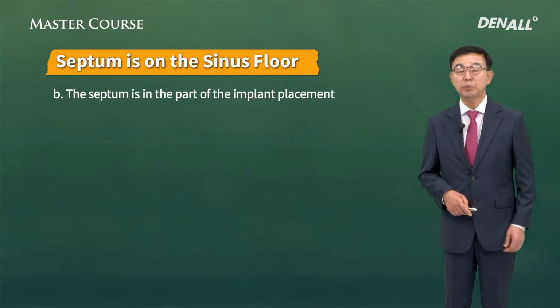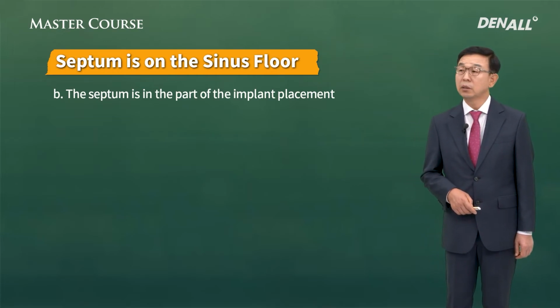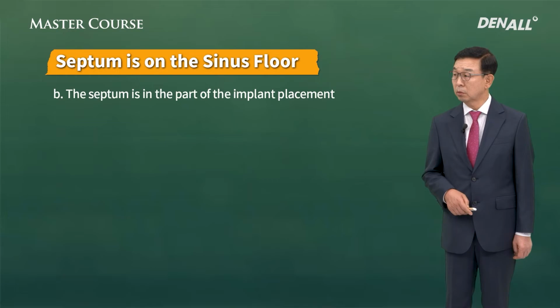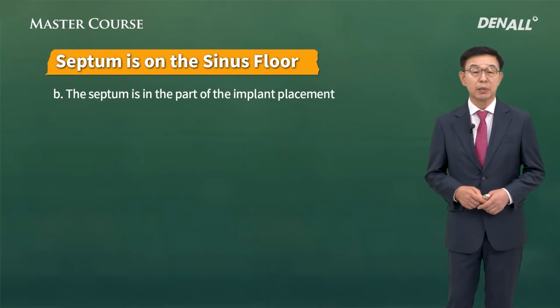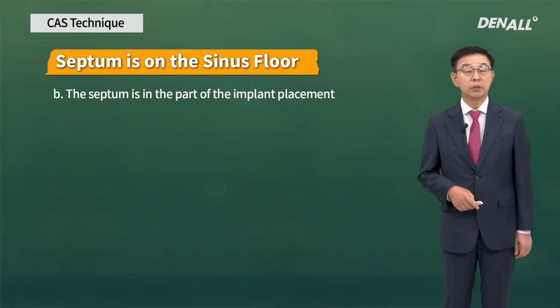At times, the septum can be in the implant placement position. In general, with the method using osteotome, it becomes very difficult. Because mounting is done, patient can be traumatized. If you use CAS kit appropriately, you can do crestal approach without causing trauma.